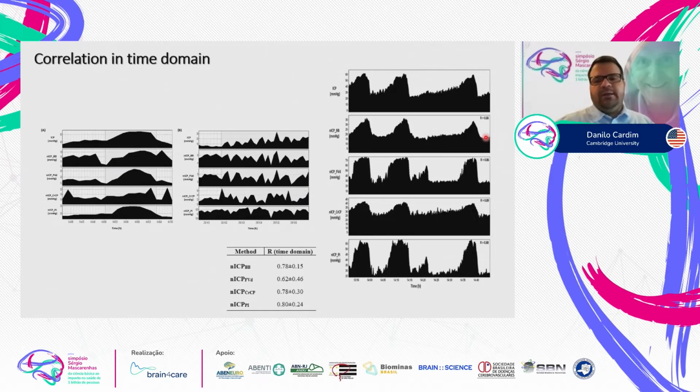So Transcranial Doppler itself is a technique that provides us with a good temporal resolution, although it's limited to the time of monitoring. We cannot nowadays, with the current techniques, have extended monitorings, for example, as we have for intracranial pressure, because it's a sensor that is located outside. But with more recent technologies, for example, robotic and automated transcranial Doppler monitoring, this may change in the very near future.